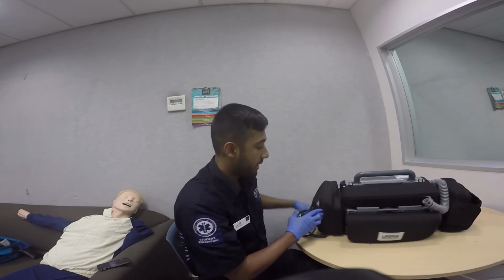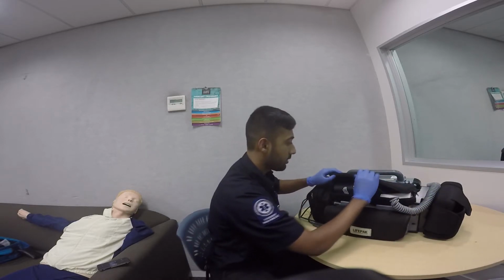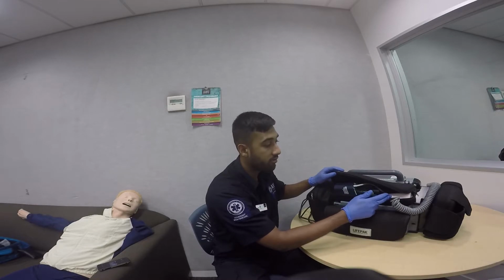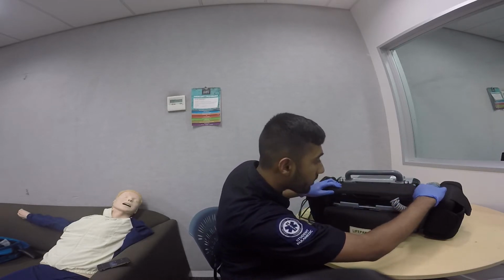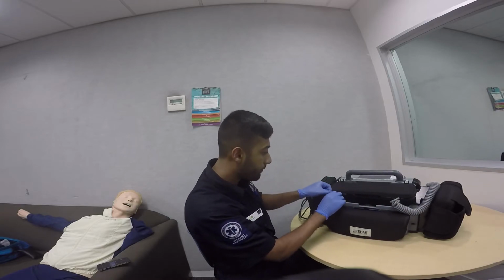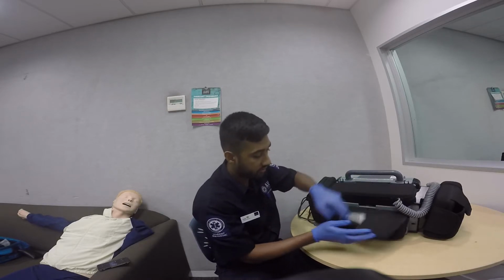On the back of the LifePack, we've got some blood pressure cuffs and a spare roll of paper. We've got different size blood pressure cuffs. And this pocket here, we've got some spare ECG dots and another blood pressure cuff.